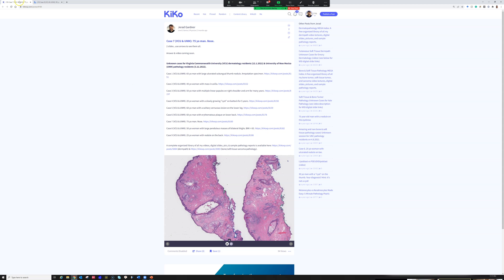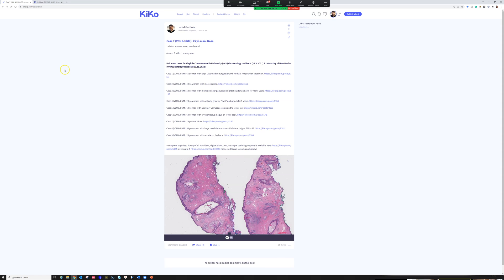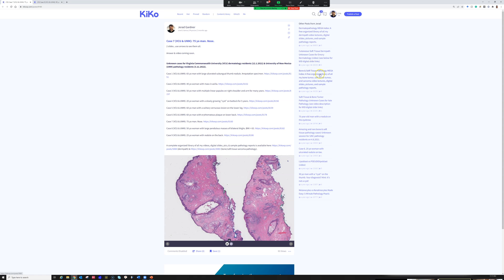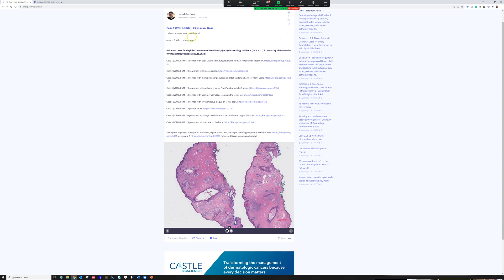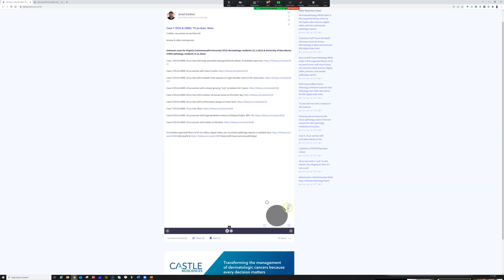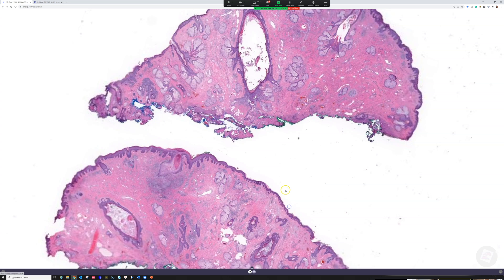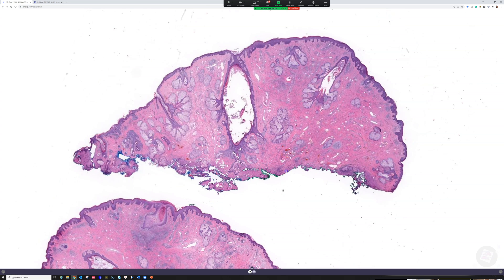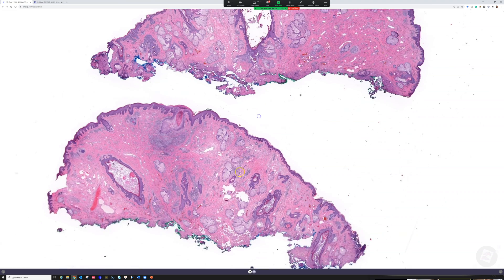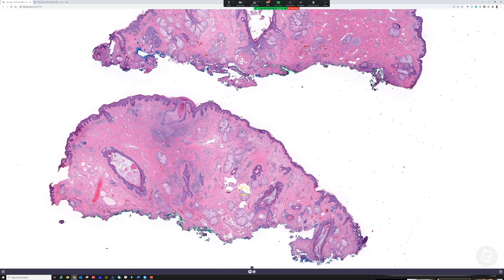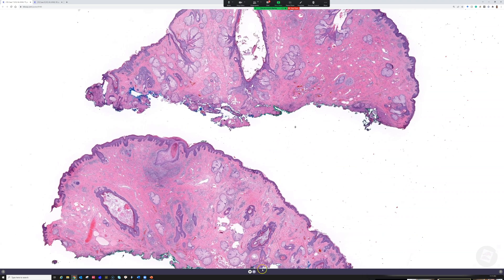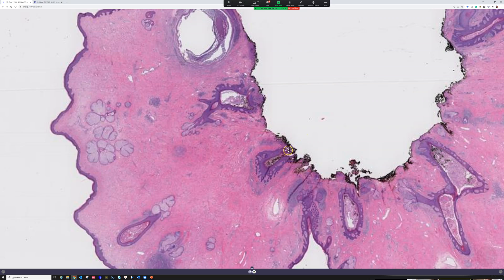Case 7 is a 75-year-old man. This is from the nose and there are two slides. I'll show you both from low power and then someone can tell me about him.